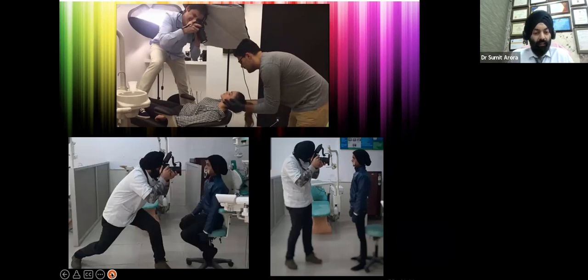Again, the third image, this is not possible because my leg is straining. You can get a good picture with this pose, but you are straining your body, and this is not well required at all, because you are not going to click in this pose for a longer run. If you have a good OPD, you cannot click every patient with this pose, and there is going to be strain at the end of the day. So all 3 poses are wrong.